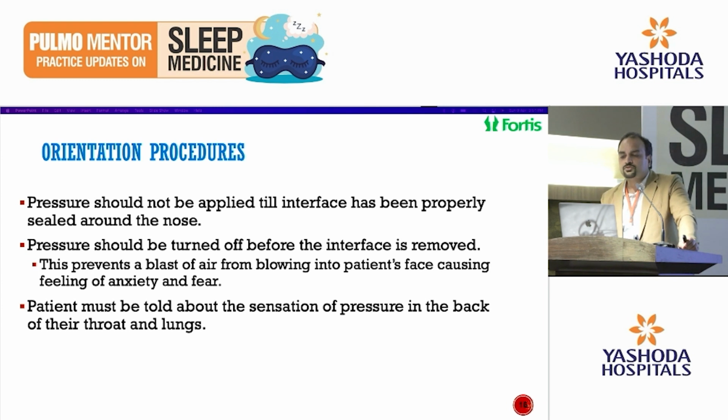So pressure should not be applied until this interface is properly connected to your patient. It should be turned off before taking it off. So this decreases anxiety in your patient. And the patient must be told about the sensation of pressure in the back of the throat and lungs, and that some intentional leak is acceptable. So all these things you need to counsel your patient about before prescribing PAP therapy, rather than just saying, no, you have sleep disordered breathing and you need to take this.